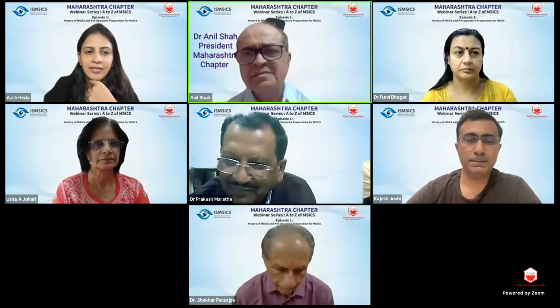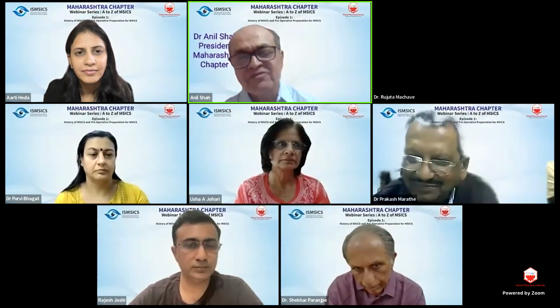Thank you. May I talk? Yes, sir. Mine is a very simple method of evaluating how to advise the patient. I just do an auto ref reading, and if an error comes, then I think that the patient needs cataract surgery. Another important thing is that if we get minus 2.5 or 3 diopter nuclear sclerosis, then I advise the patient to go for cataract surgery. This is my simple way to advise the patient for cataract surgery.